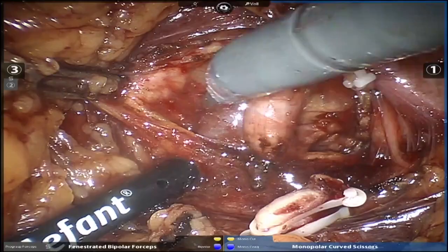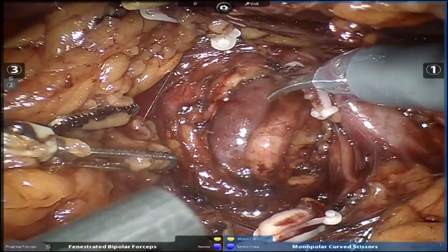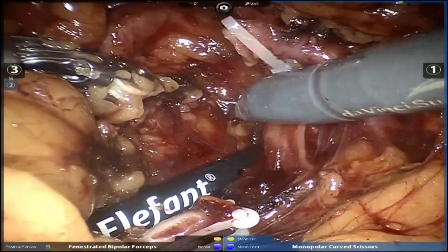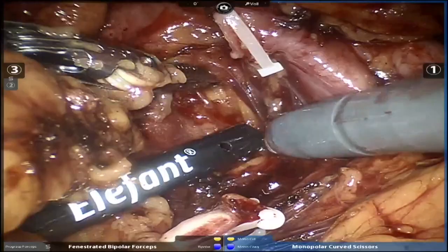It's almost like that artery is coming back to the vein. But this vein is so large, you must see it on the imaging. Okay. Otherwise, you can forget about the imaging altogether. You mean on this side? But I'm on the left side, Indy, so that means I'm going to go all the way across. Okay. This is a left-sided tumor. So that means you want me all the way across the other side. Yeah. You got it? Okay.